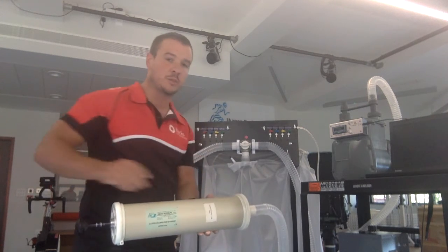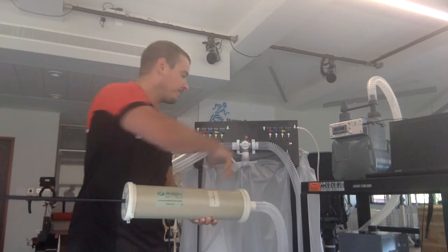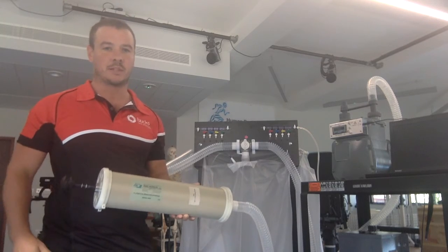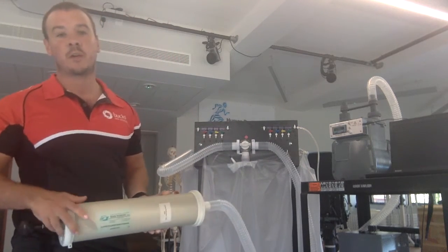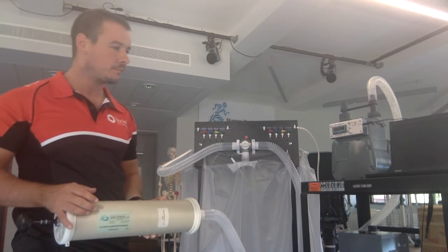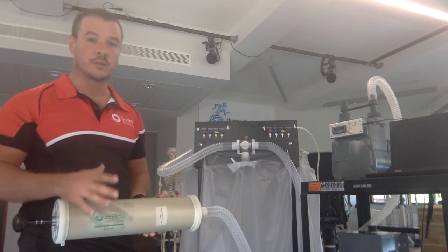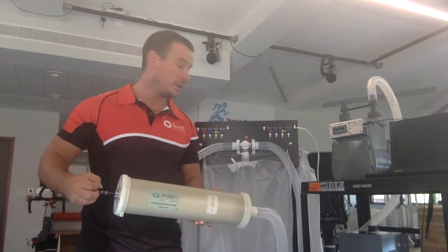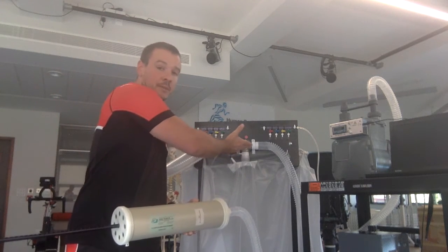Ensuring that the Douglas bag remains sealed, fully withdraw the plunger, open the Douglas bag and then reinsert the plunger. Seal the Douglas bag and you can now be confident that there is exactly three litres of air in the bag. I'm going to repeat this a couple more times so that there are nine litres of air. It's important that each time you withdraw the plunger, you ensure that the bag remains sealed.